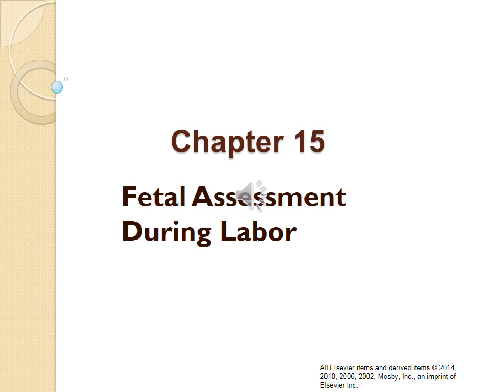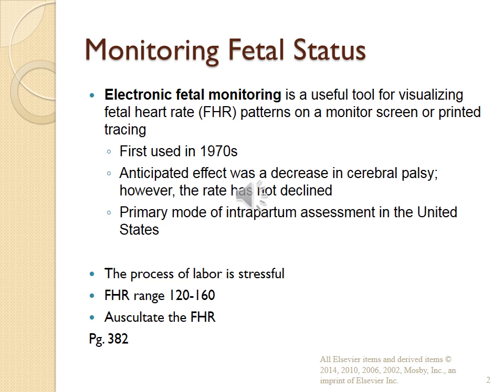This is Chapter 15, Fetal Assessment During Labor. Electronic fetal monitoring is a useful tool for visualizing the fetal heart rate patterns on a monitor screen or printed tracing. It was first used in the 1970s. They used it anticipating that it would decrease cerebral palsy. However, the rate has not changed or declined.